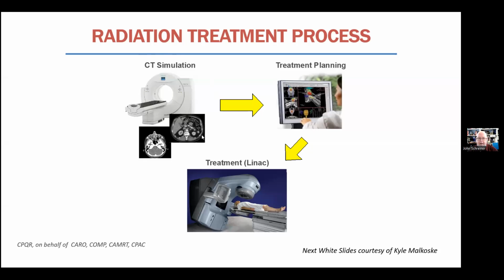These days, in many centers, the imaging to plan the treatment would be done with some kind of three-dimensional imaging system, and in particular, maybe with a computed tomography X-ray unit that can generate images of the internal structures of the body.